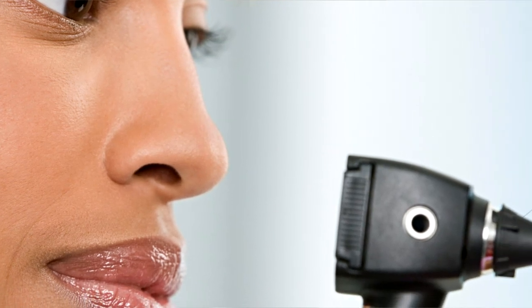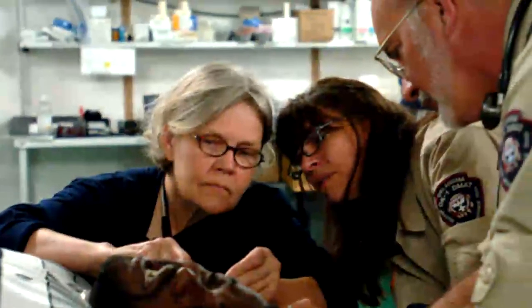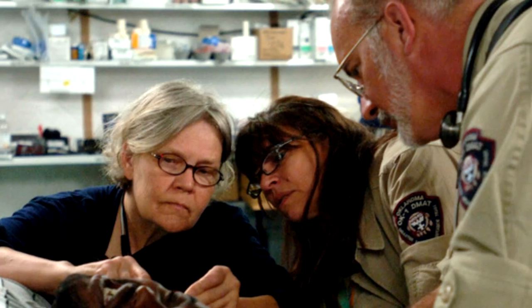As the undergraduate director for otolaryngology, I noticed that the students had a hard time seeing things through the otoscope. That's always been a problem — ensuring that the students have actually seen what you wanted them to see. I think the training of the medical student and the paramedical person who deals with ear disease has to be improved.